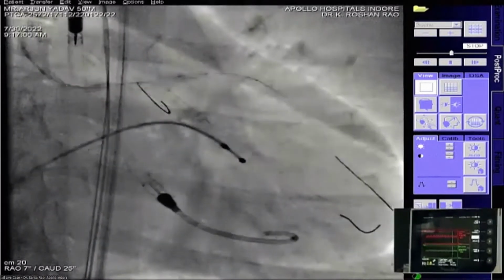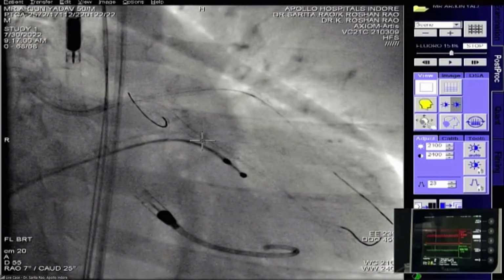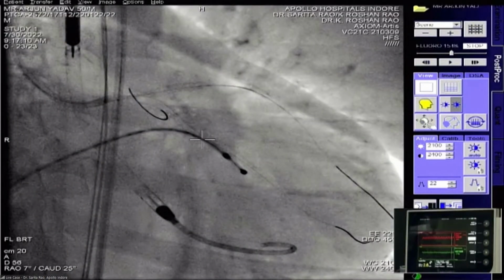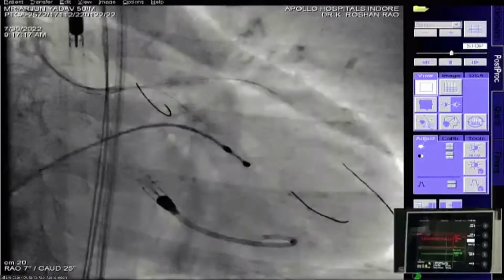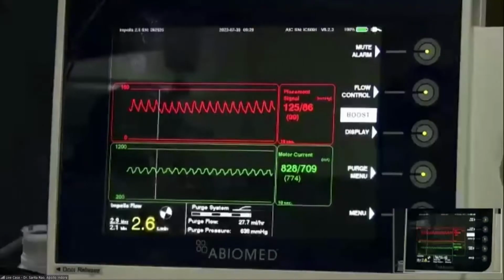That's an important point Madam is making. When you're inflating a stent in the left main, you have to be relatively quick. Though impeller support is there, many of us don't have the luxury of having an impeller. So in doing such things, you have to be very quick and plan everything properly. If you inflate it longer, especially if the patient has LV dysfunction, a vicious circle develops, and then it will be a problem. So always make sure that you're quick, at the same time be effective, and going up to the right pressures is also important.